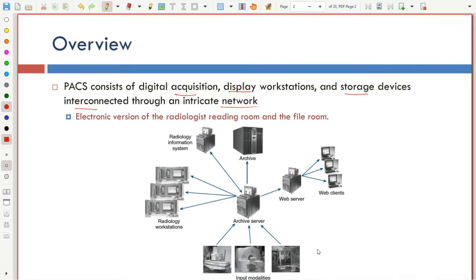If you know how medical imaging modalities work these days, for MRI, for CT, we are now collecting volumes, not single images. So usually you end up with hundreds of megabytes for each patient. It's a huge amount of data. In the report that goes to the EHR, the doctor might select a few images and write a report, just to demonstrate how he got to that diagnosis, and that's it. He doesn't include all the images. For the PACS, we store everything, and it's a requirement.